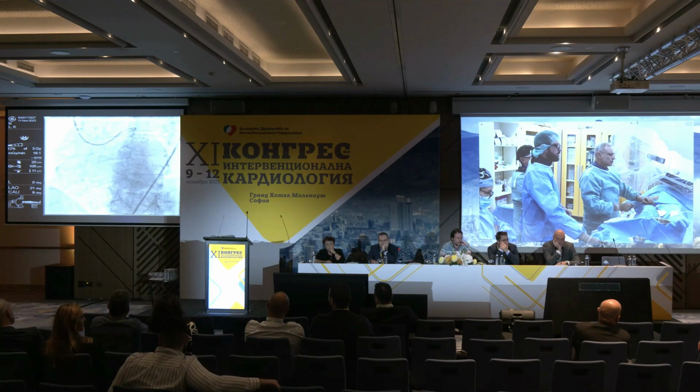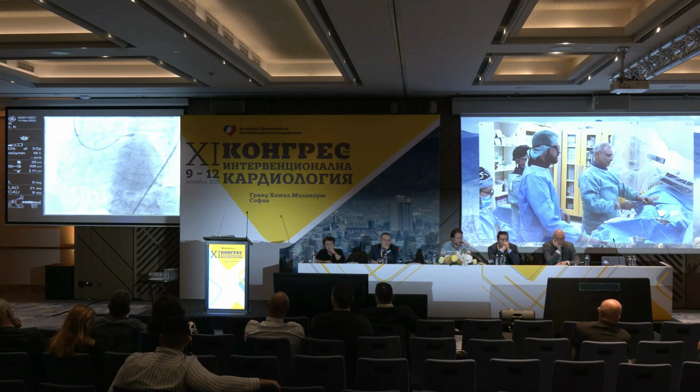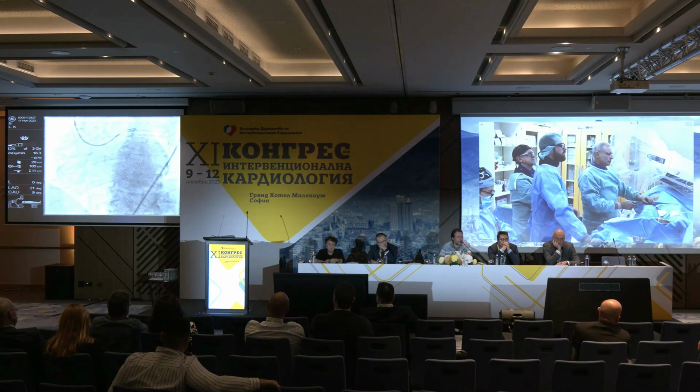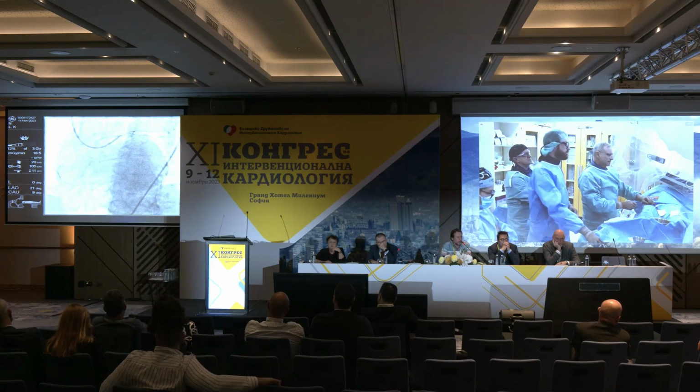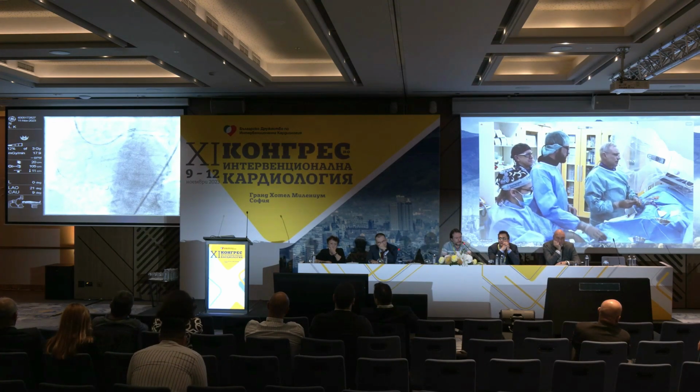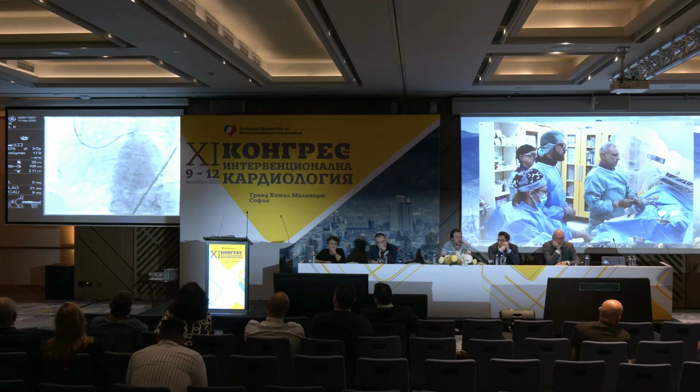We have changed completely the game in 10 seconds for this case, the perspective of that. And I can do a much safer antegrade attempt now, should that be necessary. You understand what I mean? Yeah, I totally agree. We have a very nice marker now, so you know where to puncture antegradely.